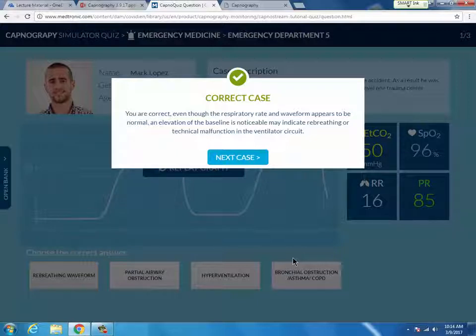Also, the same premise as a non-rebreather mask has the one-way valve so that you don't breathe that CO2 back in, all right? And so, again, what is significant about that is that sampling tube is still picking up CO2 as I'm breathing in. Does that make sense? When it really should be picking up no CO2 as I'm breathing in. So what that's telling me is that CO2 is just cycling, breathing it in, breathing it out, breathing it in, breathing it out. Okay?